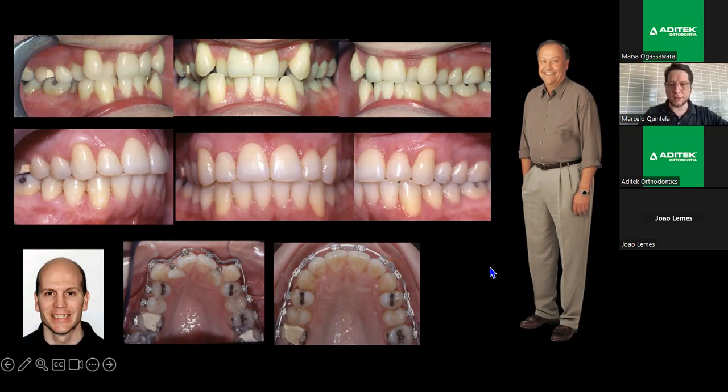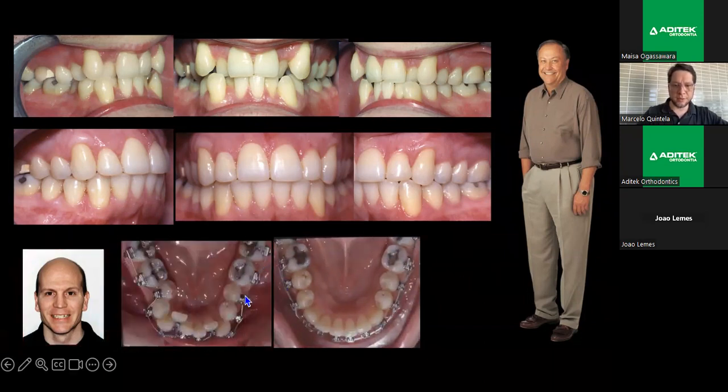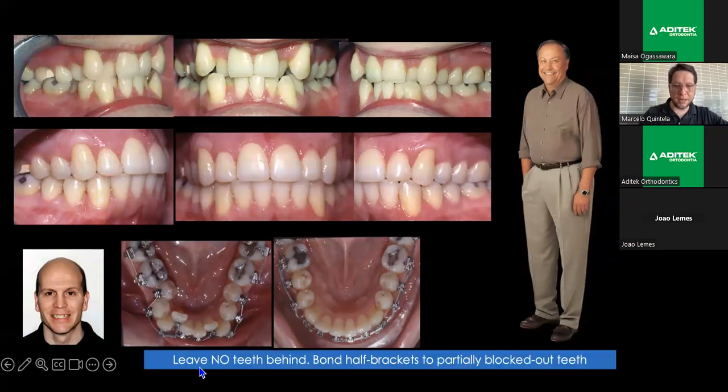Like this case, and the lower, look, the mandibular arch. How can I do that without an extraction? How can I put the two incisors in the arch? Well, the first tip is leave no teeth behind. Leave no teeth without being engaged in the arch. Bond half brackets if you need to, for the only space that you have. So bond half brackets, half conventional brackets, to partially block out teeth.